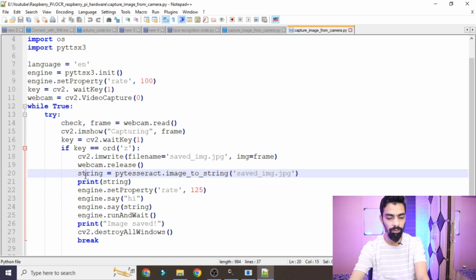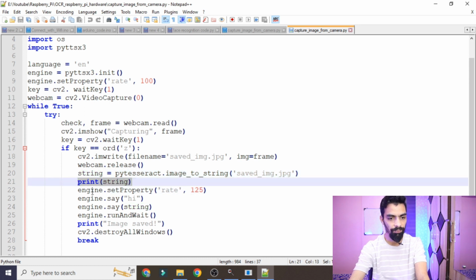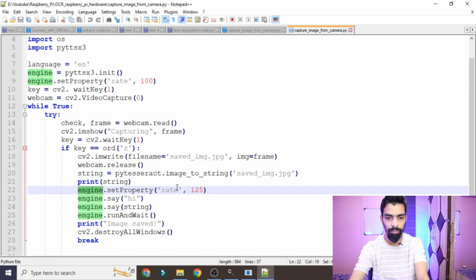So how to convert that one? We can convert it by using the pytesseract.image_to_string function and passing our image to it. So that converts it into string form. Then we are printing the string on the screen. Then engine.setProperty, we change the rate to 125 now.